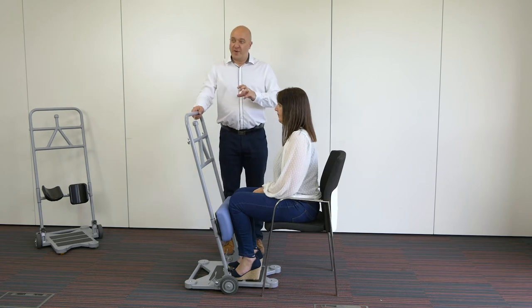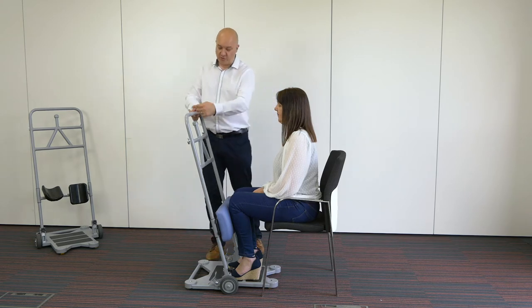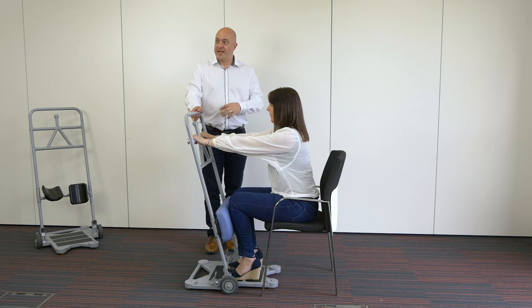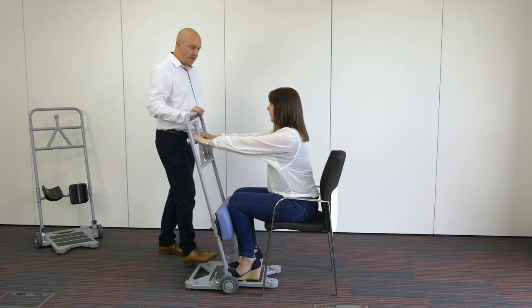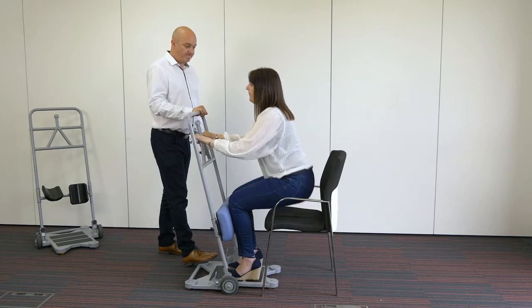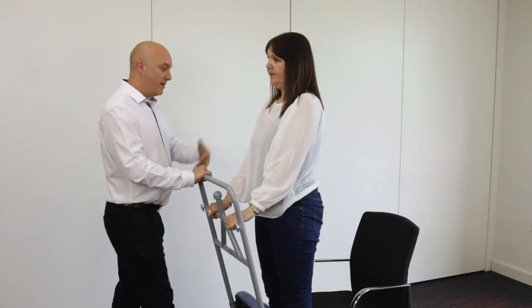We can use this in several ways. First, for somebody who's able to stand themselves — I can ask Sarah to hold on to the bars anywhere around there, and all I need to do as a caregiver is counterbalance the unit with a hand or a foot on the base, or both. I'll stand behind with one foot and hand on top, and whenever you're ready you can stand up.